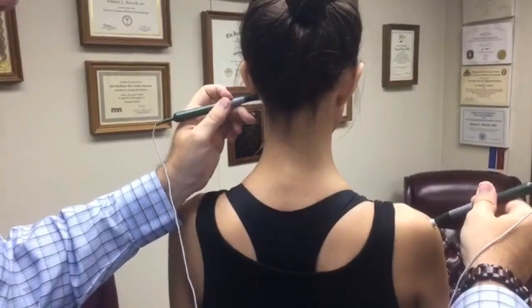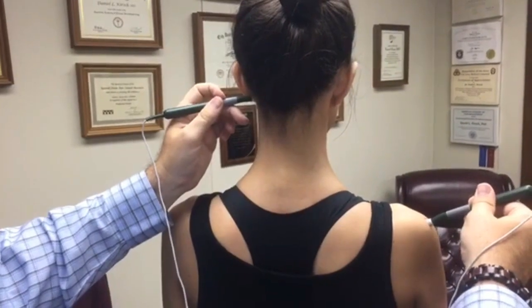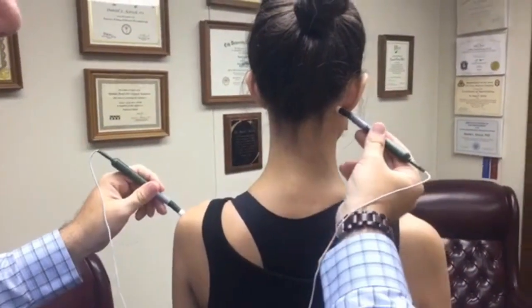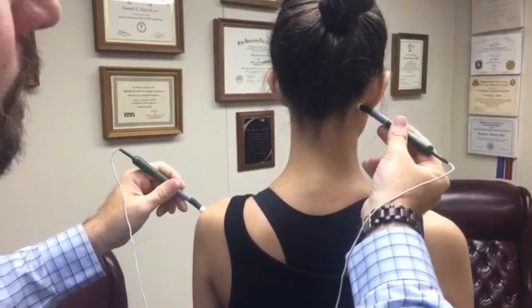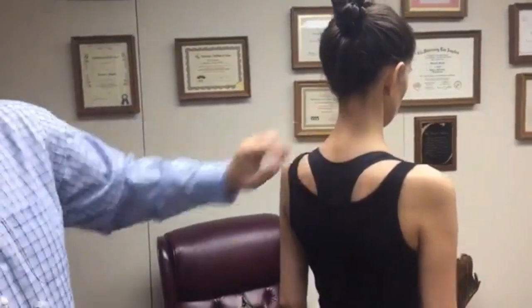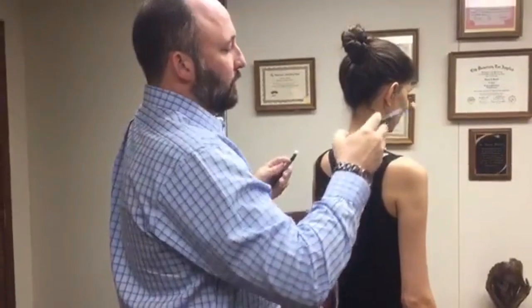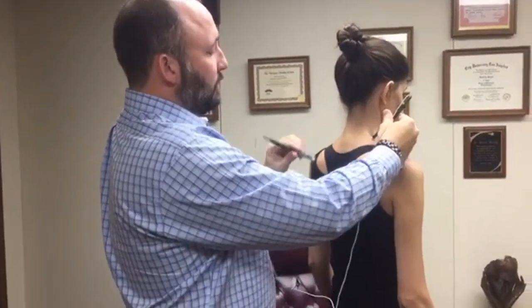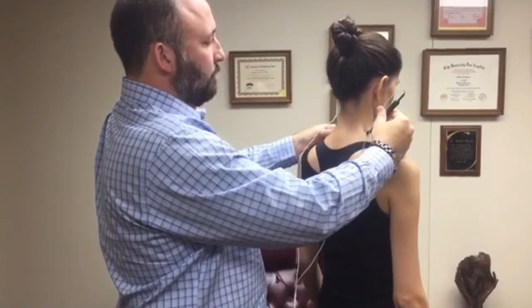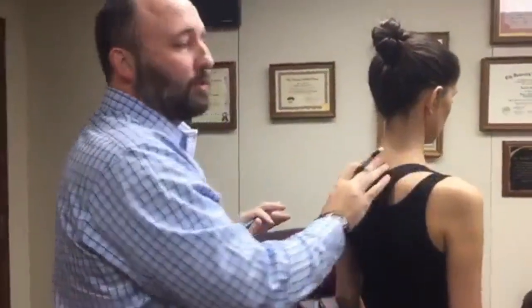Another good option is to go all the way from the shoulder to the neck — you can see the current path going through the trap and through those neck muscles. Ten seconds there and ten seconds there. If she still said she feels pain on one side, wherever she points I'd put one probe there, leave it, and walk the other probe around ten seconds at a time, going all the way across her neck and letting that current travel right through that worst spot of pain.